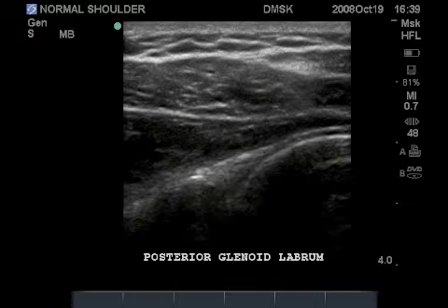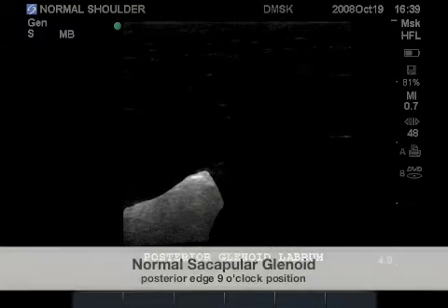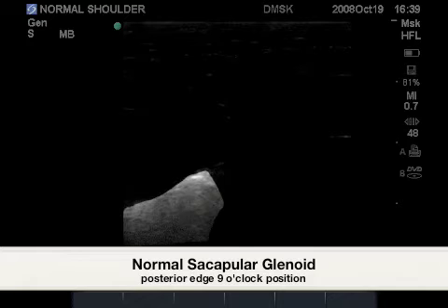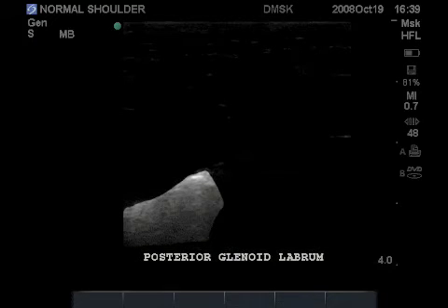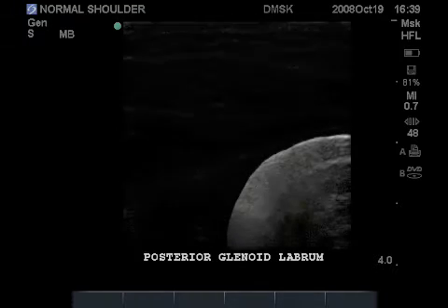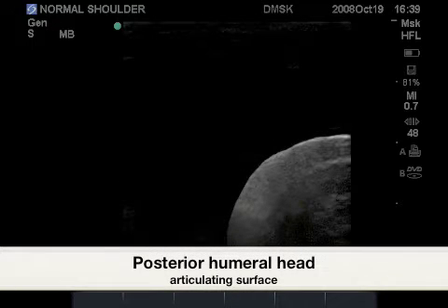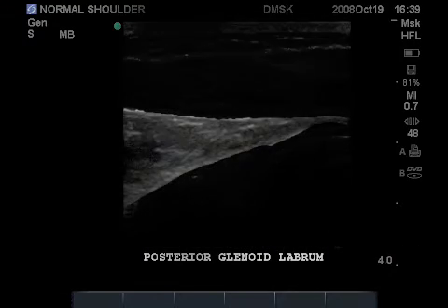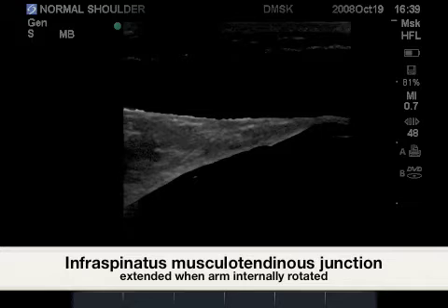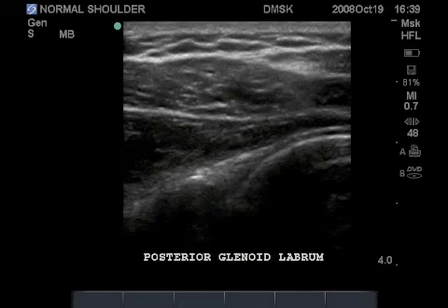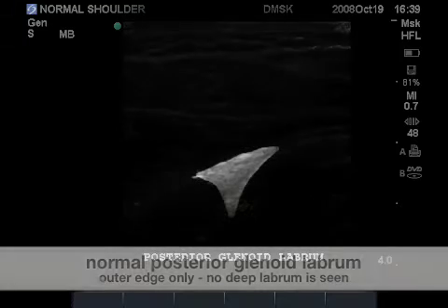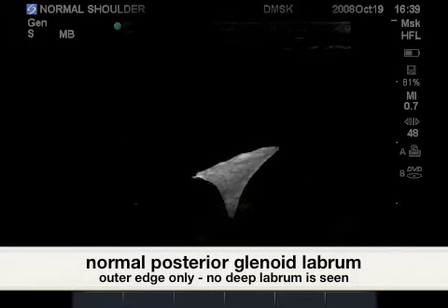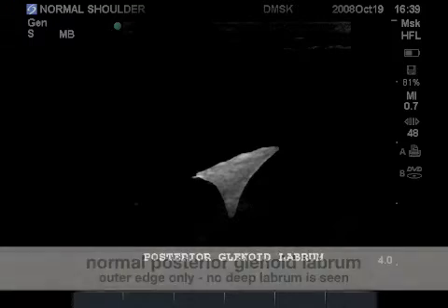The corresponding ultrasound image of the posterior glenoid labrum shows the highlighted bony glenoid of the scapula, followed by a highlighted image of the bony posterior humerus with a dark rim over the bone, representing the posterior articular hyaline cartilage. Highlighted here is the infraspinatus muscle belly, seen obliquely in this slice, allowing a clear image of the posterior glenoid labrum, highlighted as a hyperechoic triangle.